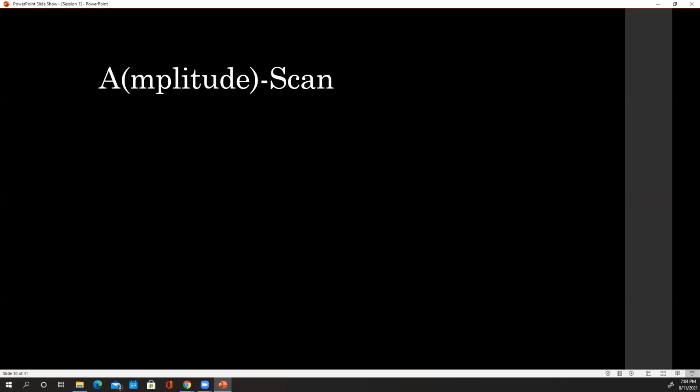Now, mind you, one of the best parts about this particular lecture is that both the ultrasound that you use and OCT are basically the same technology, but the former uses sound and the latter uses light, but they act the same. They're both things that have a wavelength that bounce off of things, and then we determine what that reflection pattern is. So when we say A scan, what does the A mean? It's not like A means the first scan and then B scan means the second scan, although it worked out that way. A means amplitude. So what does amplitude scan mean?